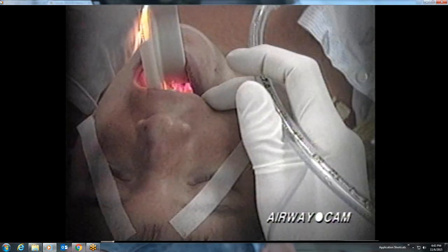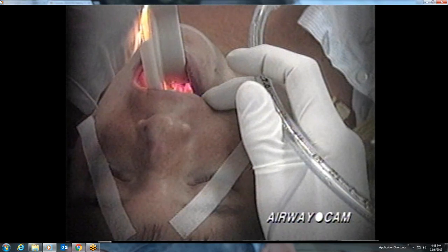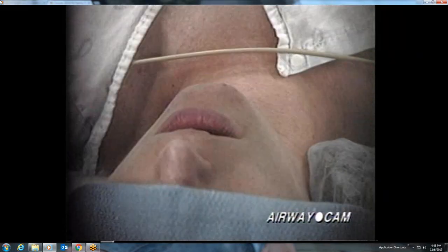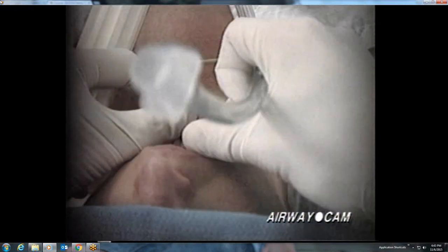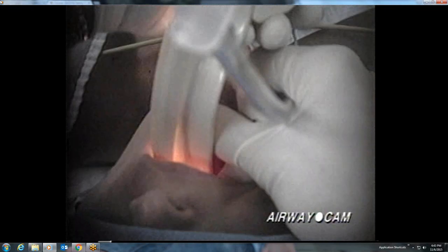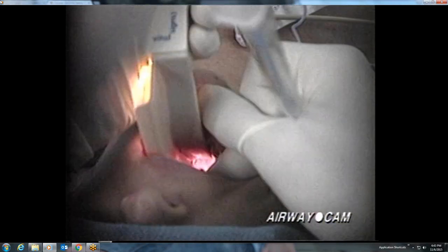The laryngeal view in this patient does not include the white of the vocal cords, but the posterior cartilages and interarytenoid notch are well seen. The small dark hole above these structures is the glottic opening. The following intubation is also with a Macintosh III blade. The scissor technique is used to open the mouth, and the pink posterior pharynx is well seen, followed by the epiglottis.